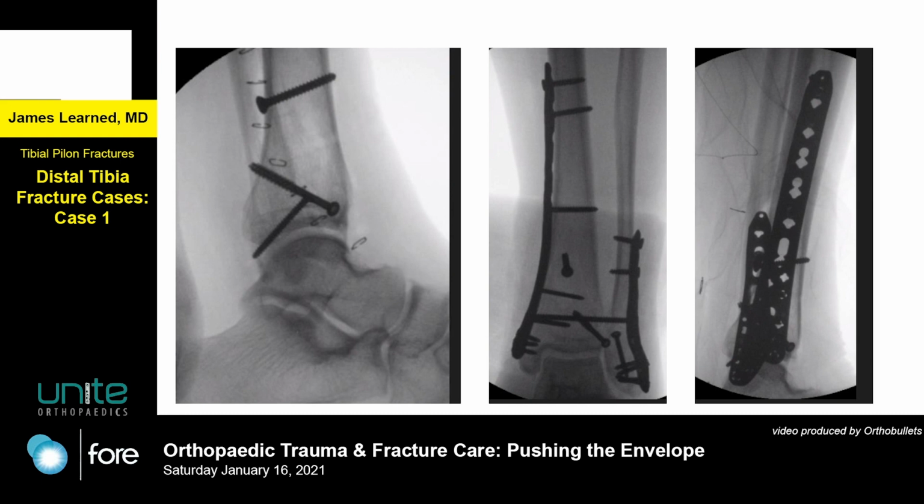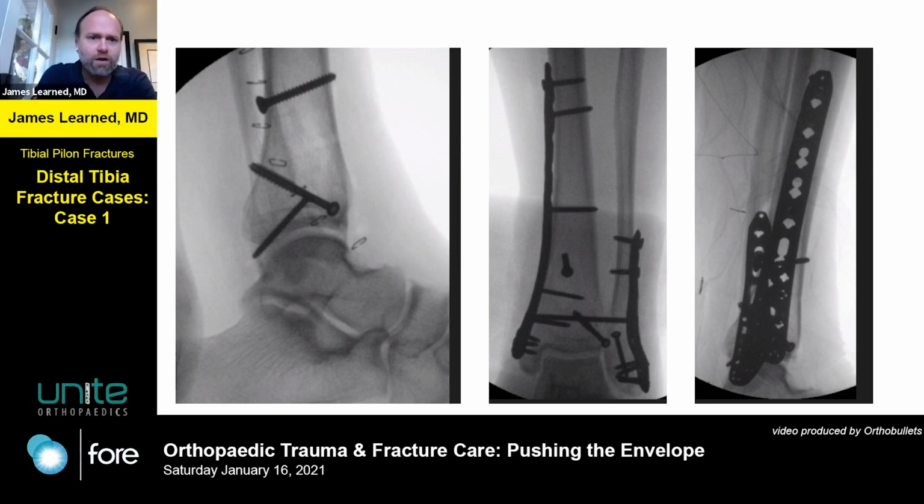As far as lag screw placement, yeah, that was an open reduction. If I was going to do this in that way, I would have a large Weber clamp, so I could have a stab wound right on the crest of the tibia, really just direct anterior, anteromedial. I would have it outside the skin, pushing on the spike, and I'd probably have a drill hole or some sort of direct control of the posterior portion of the joint. I'd stick a large shoulder hook or other device in to control that, and I'd be pulling down on the joint until I get it all the way out to length, and I use my Weber clamp to squeeze it together and dial that spike right into the apex.